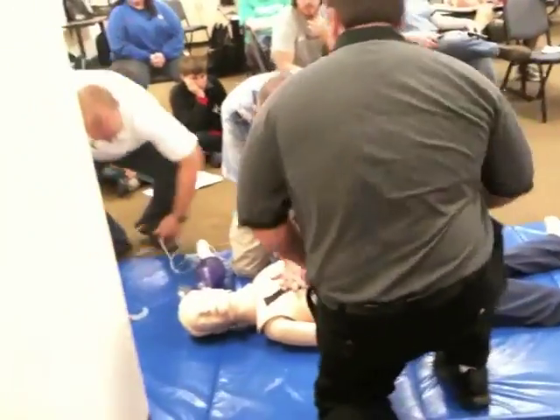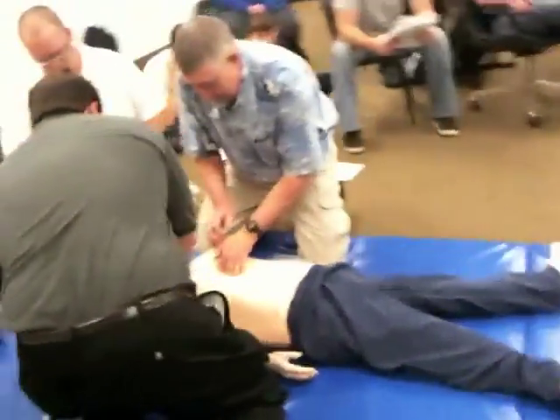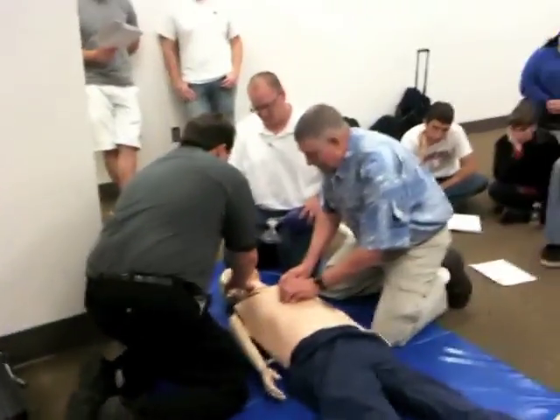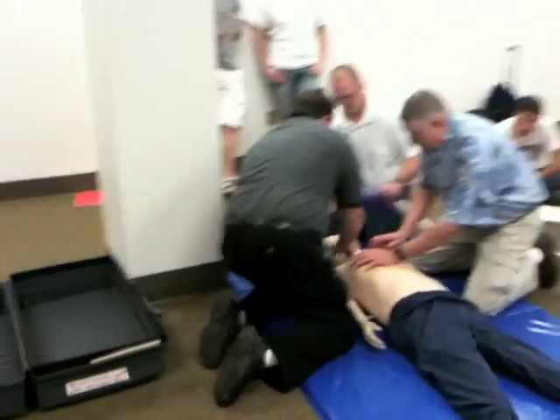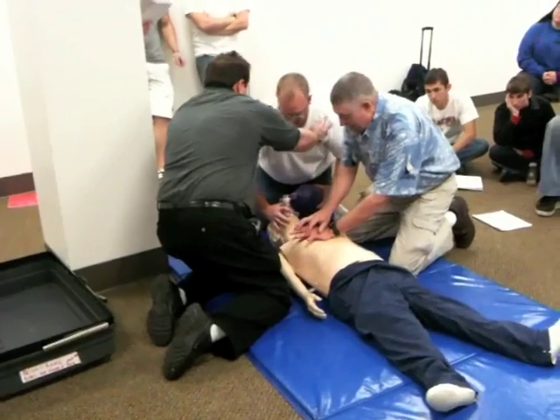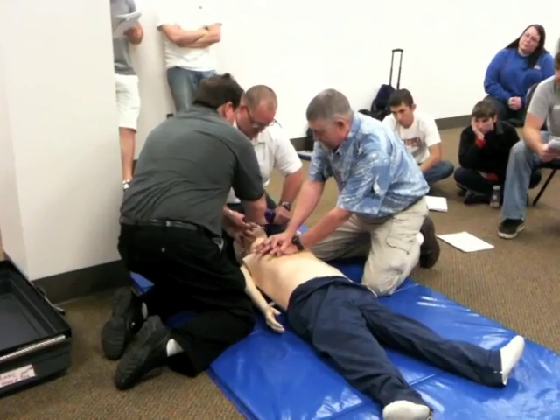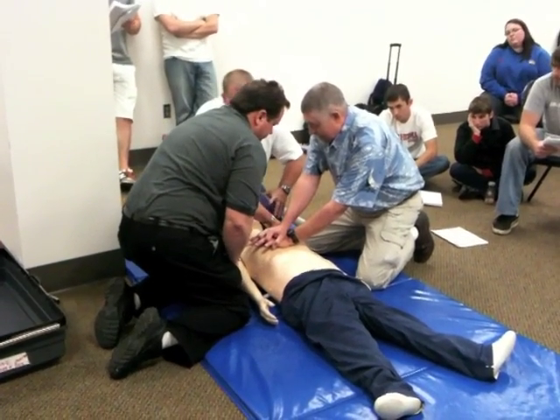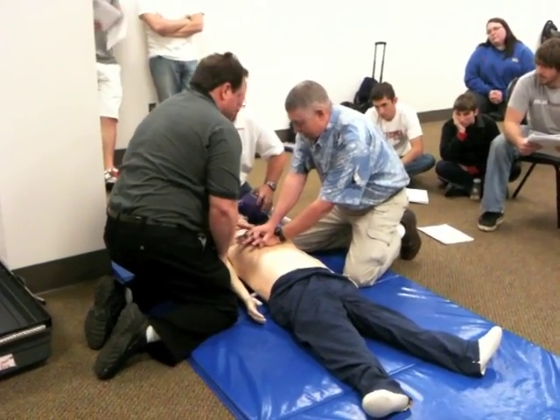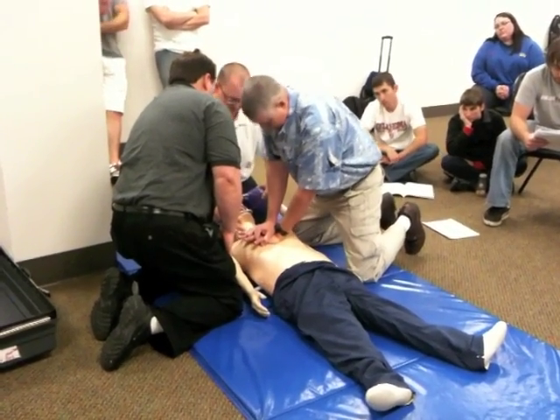Hello sir, can you stop — just for a minute. I'm going to check for a pulse. Sure enough, there is no pulse. Get two breaths, please. I'm going to listen with the stethoscope. Start chest compressions, sir. Your chest compressions are generating a pulse — keep those up.